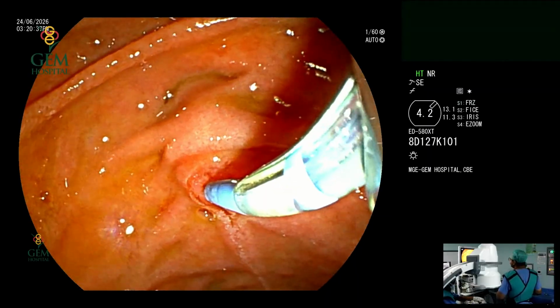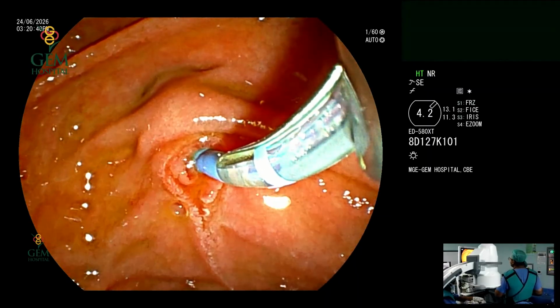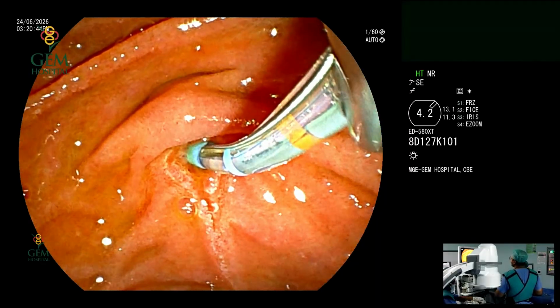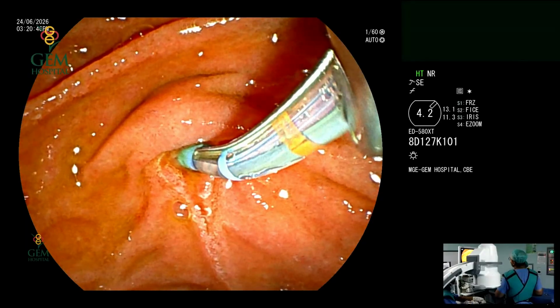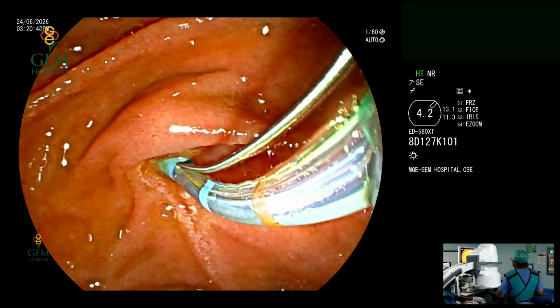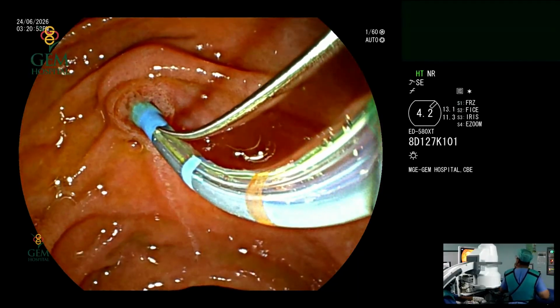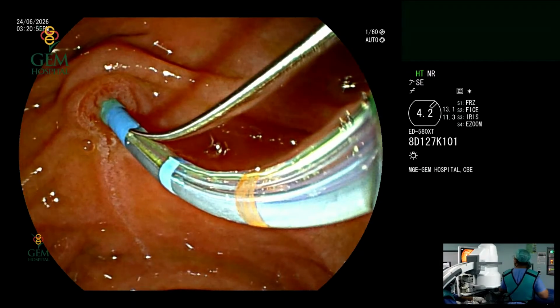Basics first. Let's not rush towards things. We cannulate, we do not push. We make sure the sphincterotome is bowed. Bow, please. Change the axis. Make sure you are in line with the papilla.